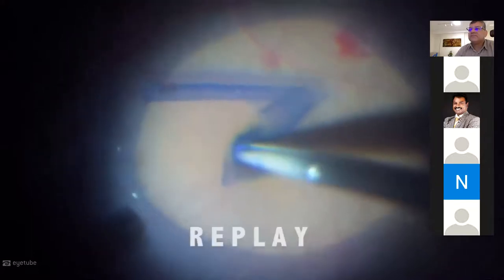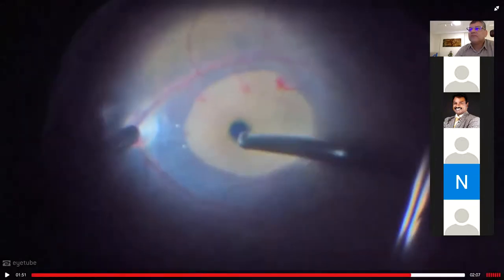You see the membrane rolled over itself in a tubular fashion, making it easy. The ILM is already there. We don't need to do anything else at this point unless the ILM escapes out. You've got to be very gentle and avoid too much flow. Keep the intraocular pressure around 30–35 mmHg — you should not raise it more. Otherwise, the flow from the infusion line is going to displace the internal limiting membrane.